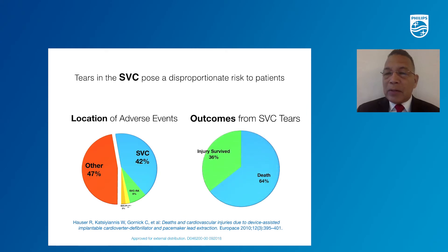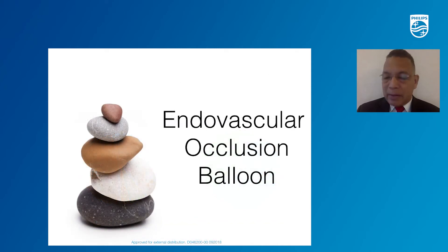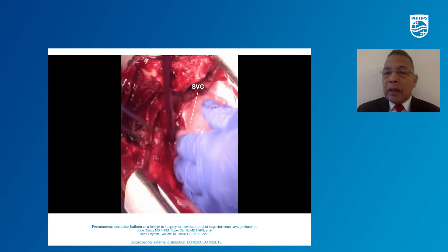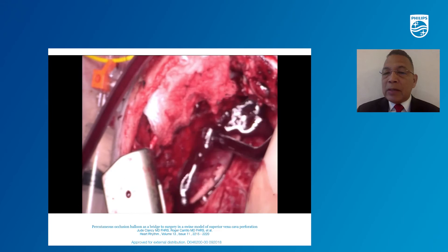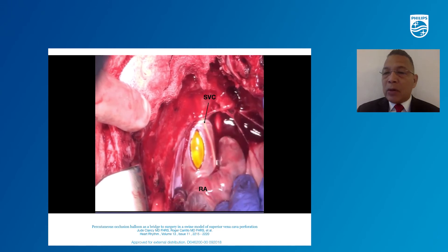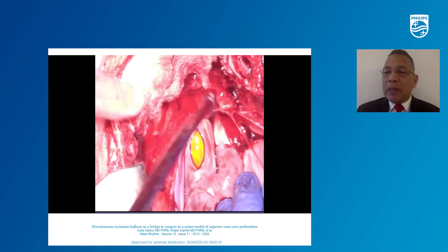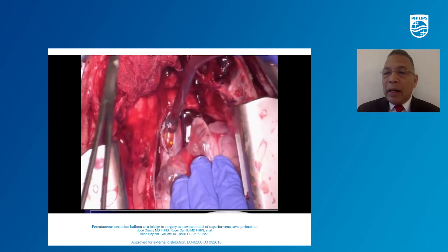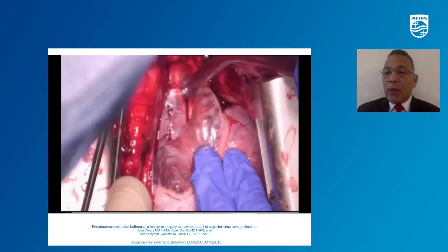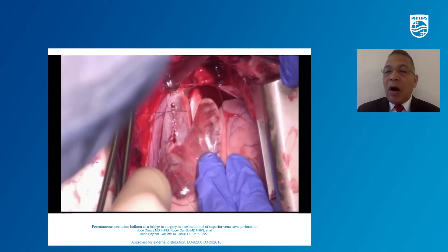Superior vena cava lacerations account for half of the events, but they are the most lethal. For that, we use an endovascular occlusion balloon. As we see in this model, the superior vena cava is being opened and you can see immediate exsanguination. Once we deploy the endovascular occlusion balloon, there is decreased bleeding from the injury. In this model the SVC also contains leads, and as you can see, we can repair the superior vena cava injury off bypass just with the use of the balloon.